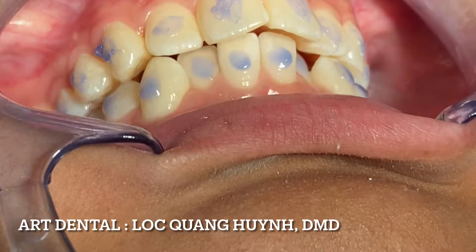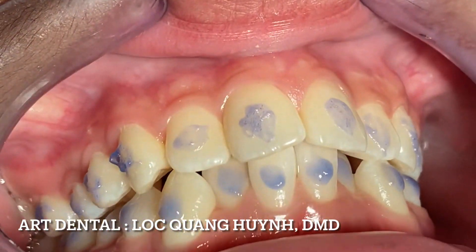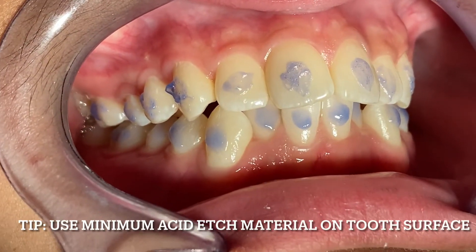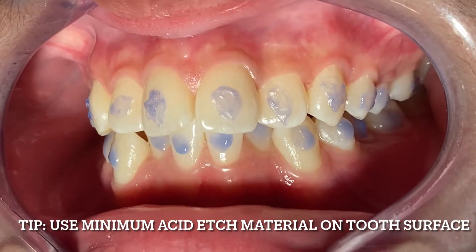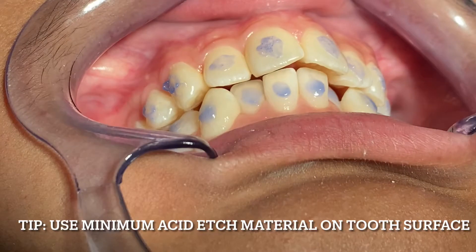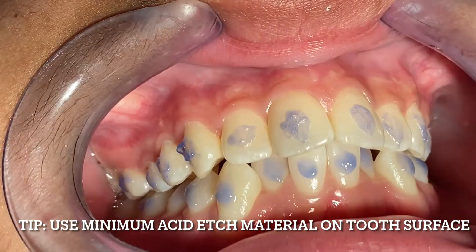The other thing I would like to talk to you about is how to save your etching material. As you can see, I don't use a lot of acid etch to etch the teeth — very, very little material. I've seen a lot of videos with dentists who put so much acid etch on the teeth, almost everywhere.